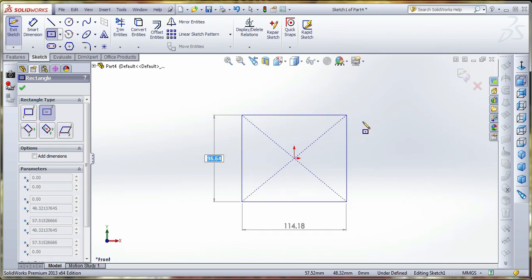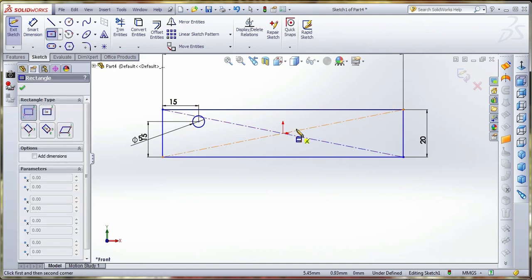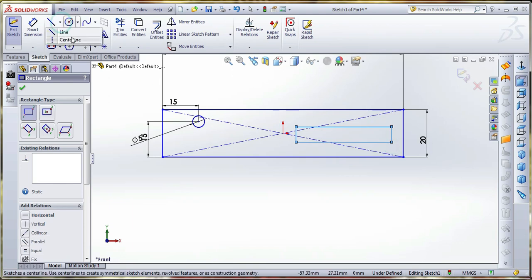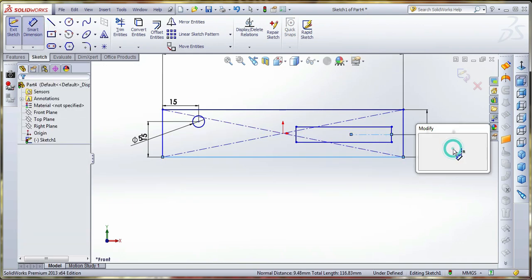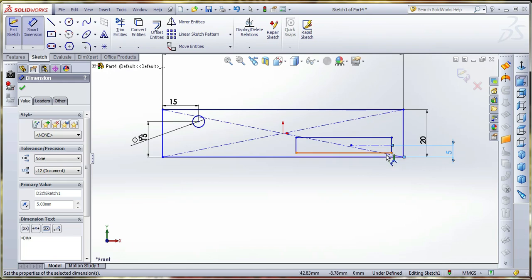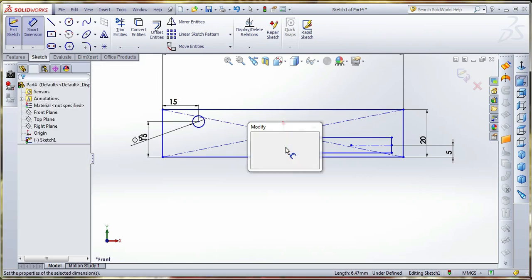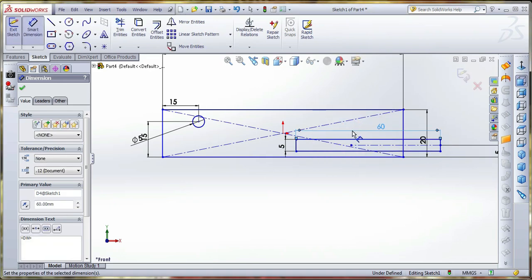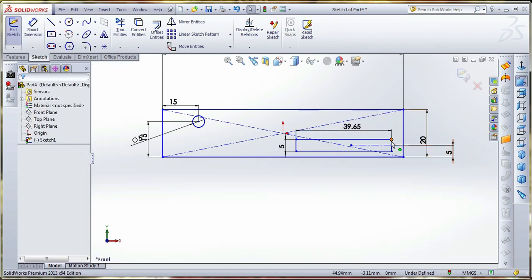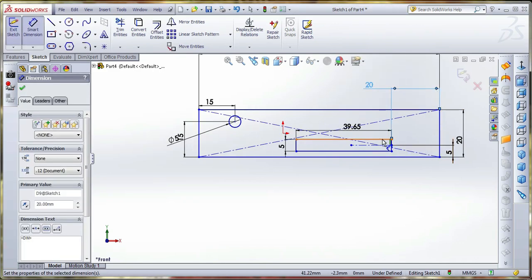Here we draw the final mechanism, which is located here to connect with the frame. Okay, this center to this bottom distance is 5. The thickness is also 5. Total length is 60. This distance is 20. This is 60.